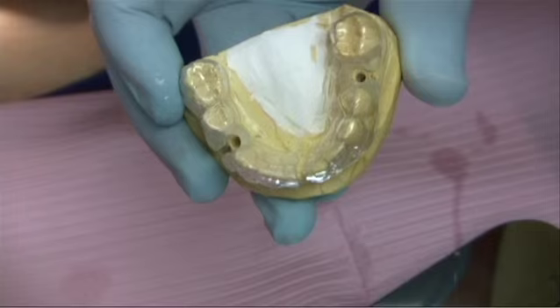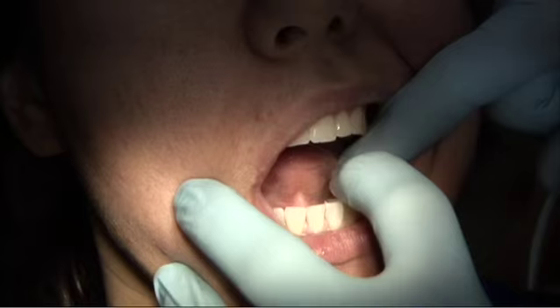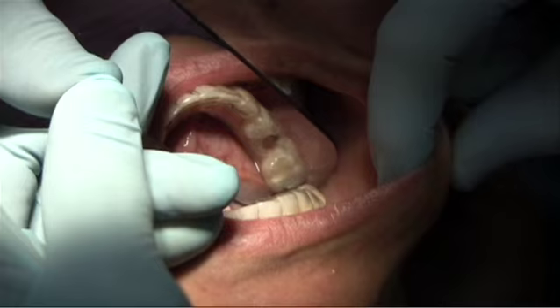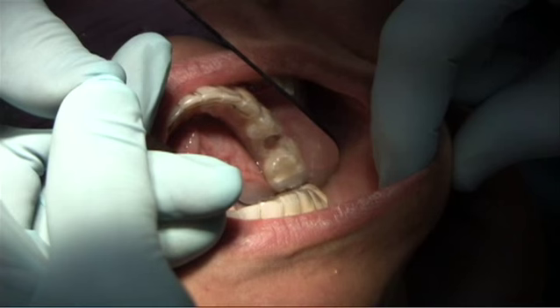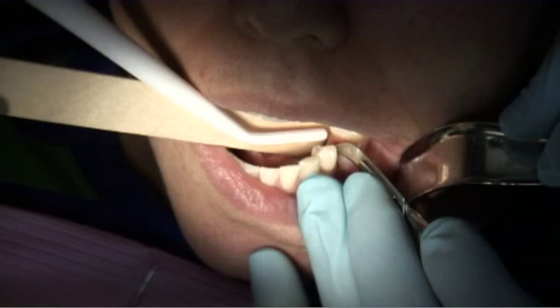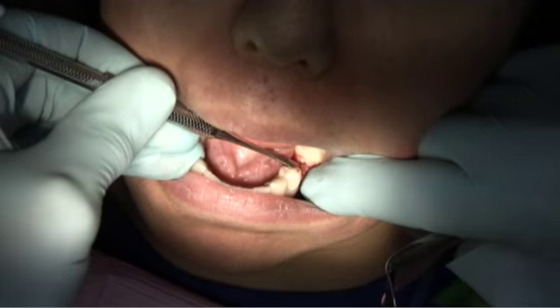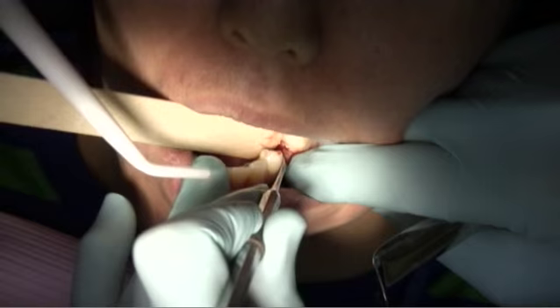The surgical guide is removed from the model and tried into the mouth. You can see how easy the guide fits. The guide is flexible for easy insertion but at the same time rigid in the drilling area. When fabricated properly, the guide will require little if any adjustments in the mouth. The guide is then removed and anesthetic administered. A number 12 blade using a slightly crestal incision extended to preserve the papilla is made to reflect a small flap. Preserving the papilla will enable evaluation of the tissue height to the crest of the bone, which can be determined with the Verbin depth gauge.